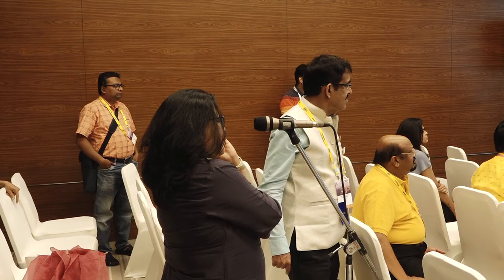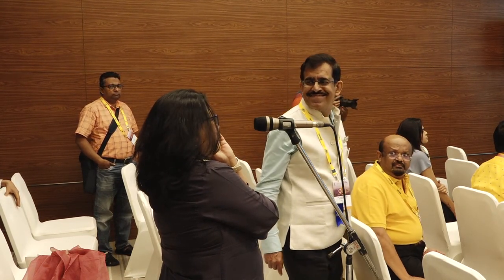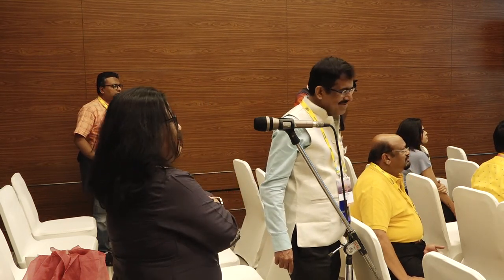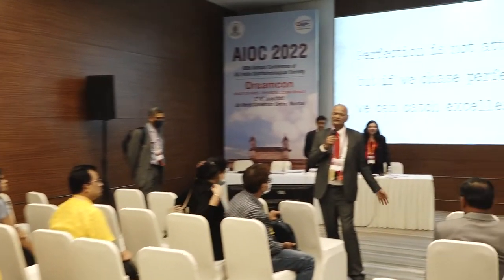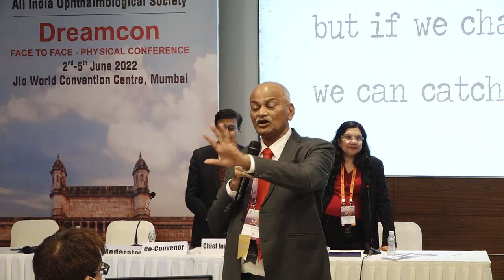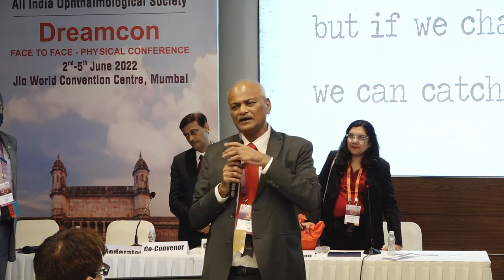Sir, can I do a superior and put an infinity suture? That you can do, but why are you doing sutures and all other headaches? I will tell you, go for temporal. Why should you sit temporally only in phaco? In my opinion, you can sit temporally in SICS also. Yes, sutures can definitely help, but not for 3 diopter. If it is 1 diopter, suture will help. But for 3 diopter, temporal will help.